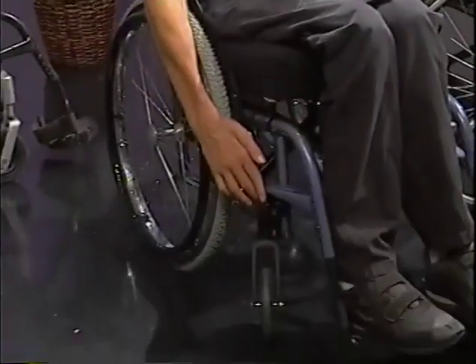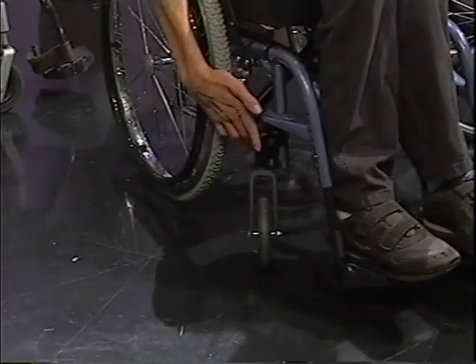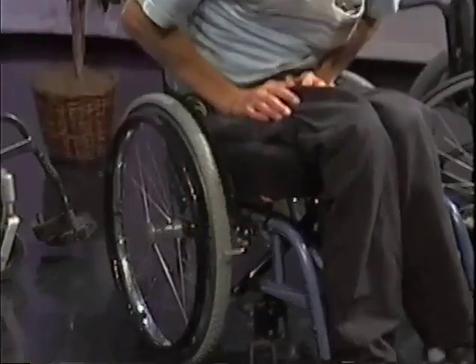So when you're considering your front ends, try to get them dialed in right, and if you can, keep the fork in front of the down tube, not behind it, as in this situation. This creates a dangerous situation, and it's something that I'll have to change.